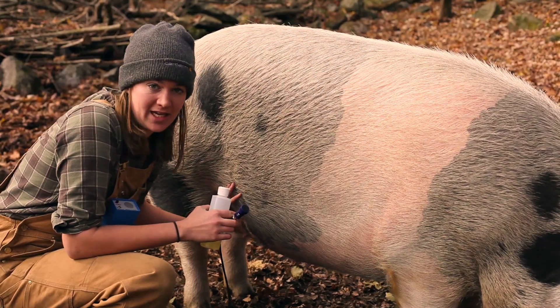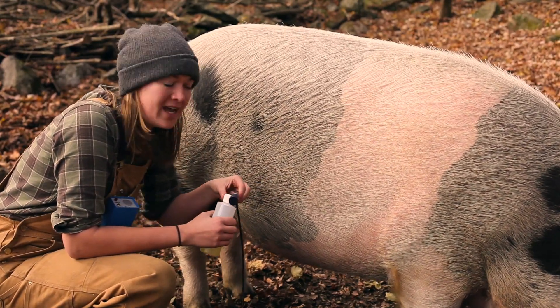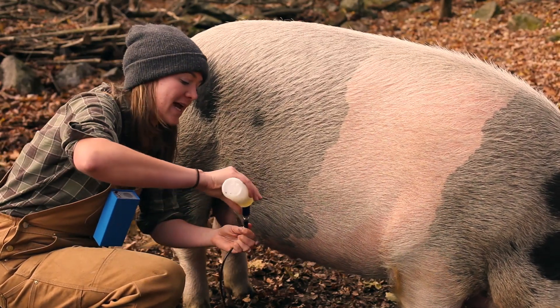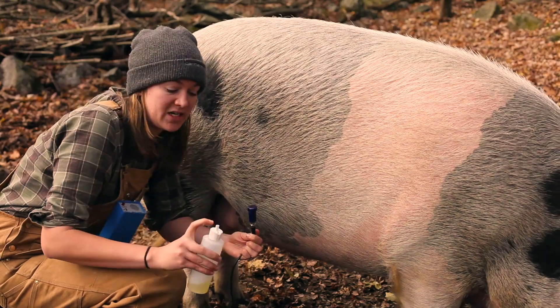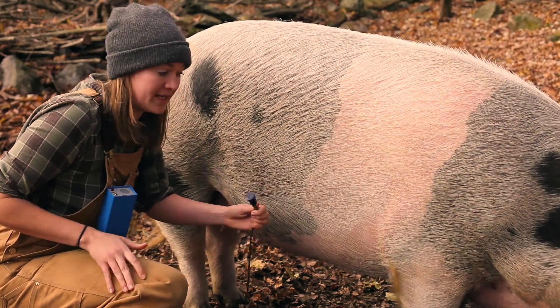You can check technically as early as 18 days post-breeding if they do have a large litter. Amniotic fluid can be detected, but if you don't detect anything it doesn't mean that she isn't pregnant — it just means that she doesn't have enough fluid to detect yet. So I'm gonna get started.